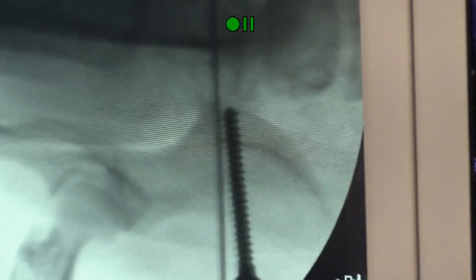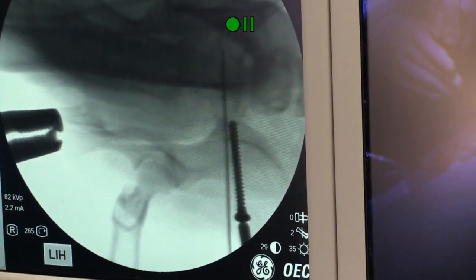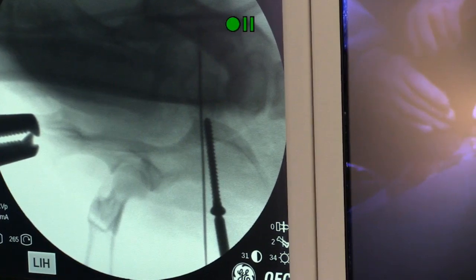So you can see I've dropped that screw in now. It's gone through the cortex of the hole that I've made, the oversized 3.5 hole in the ilial wing, and now it's about to engage into the sacrum. So just periodically check as I'm screwing this in to make sure that it's going where I want it to go.